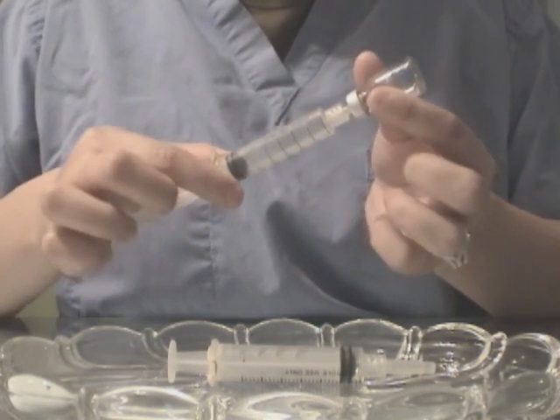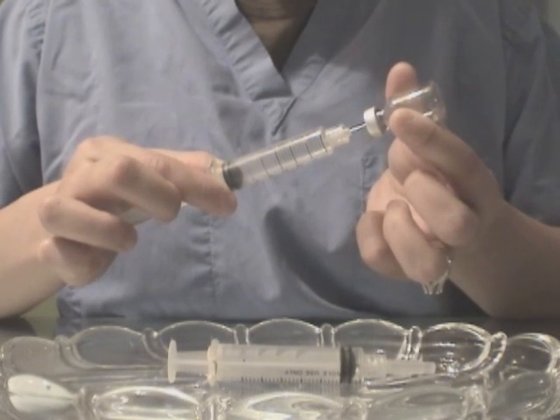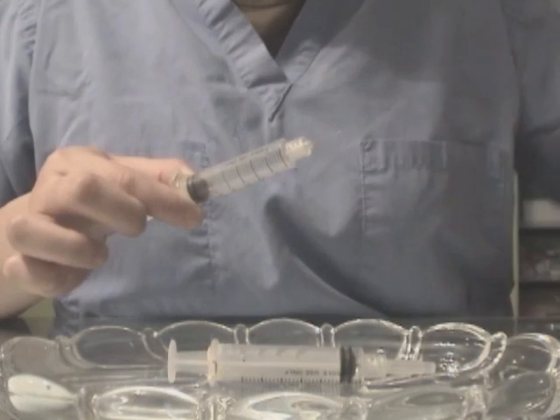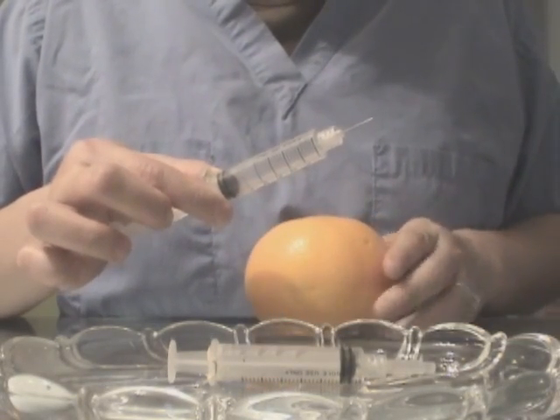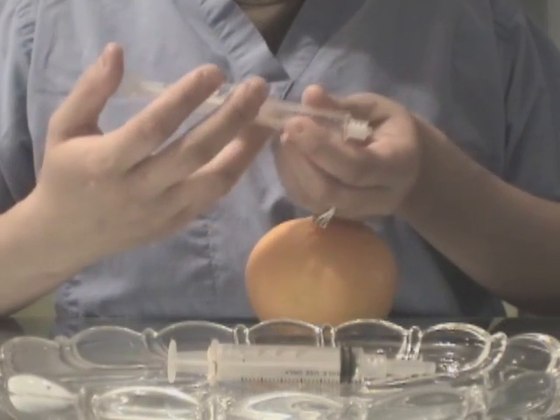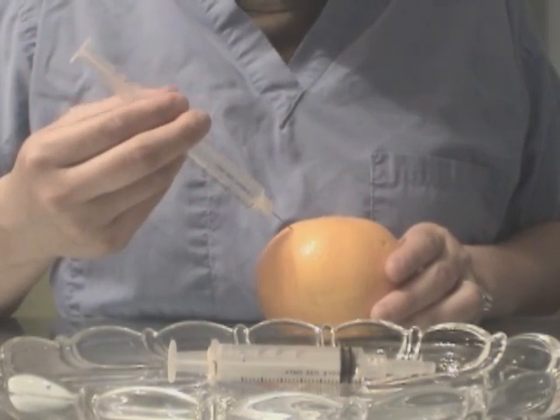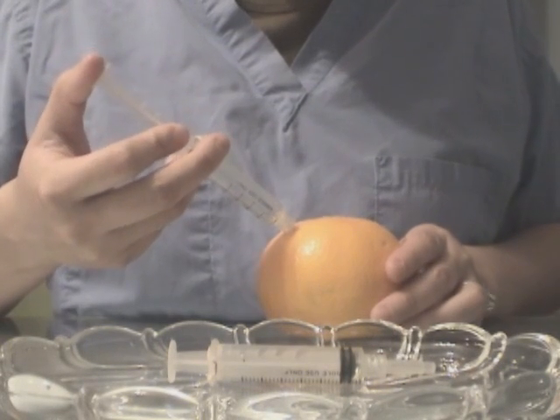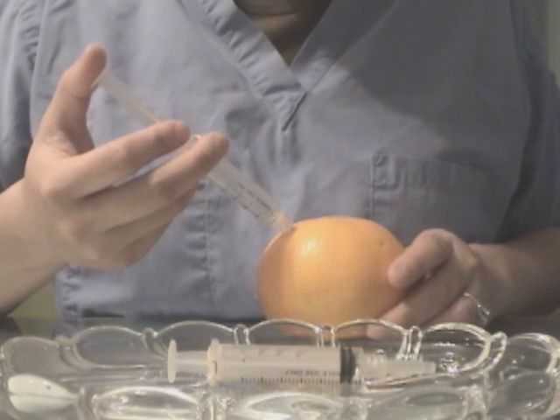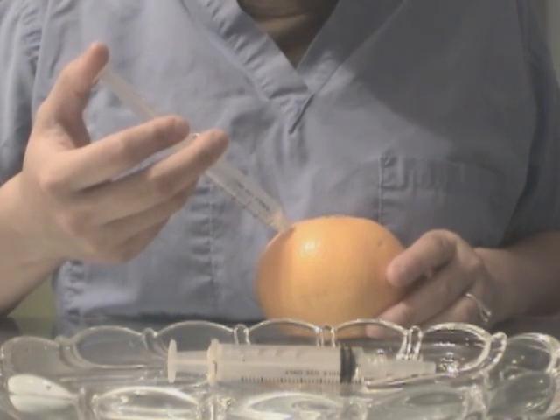Then, you want to go ahead and remove the needle from the container. Then, you want to go ahead and inject into the area. Make sure you aspirate as usual. I am not going to be aspirating in this demo, but this syringe will be able to provide that kind of action so you can still aspirate.